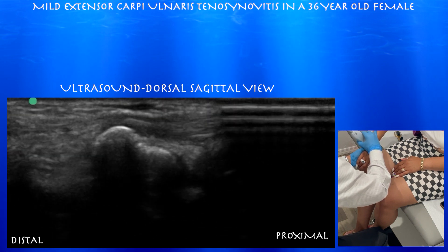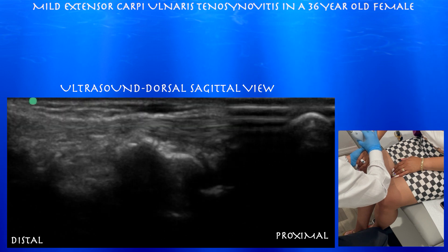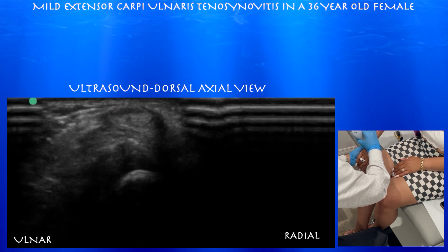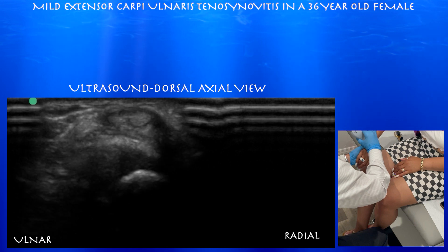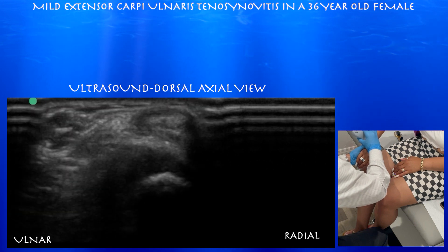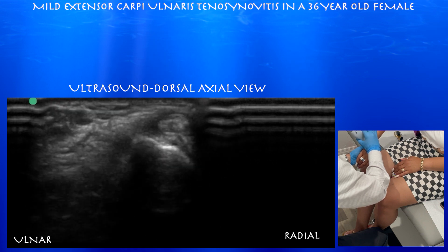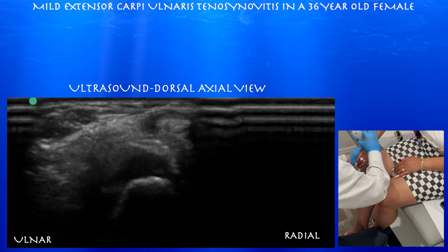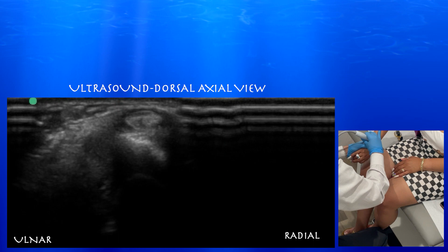You can also see the triquetrum — this is where she's tender. She has a little thickening. Here you can appreciate some mild-to-moderate tenosynovitis around the extensor carpi ulnaris tendon. The short axis showed a little bit of inflammation or tenosynovitis around that tendon as well.